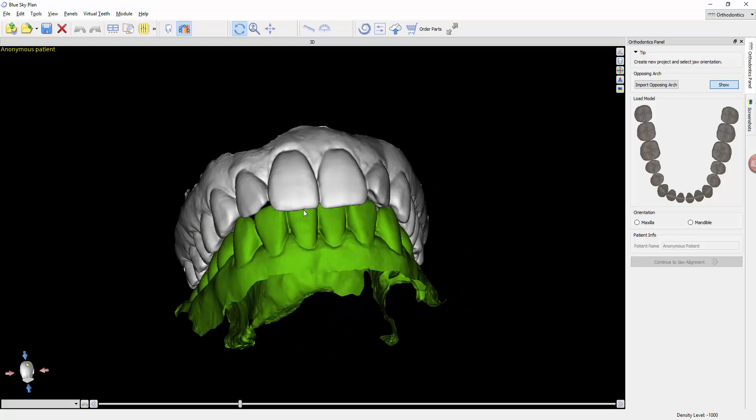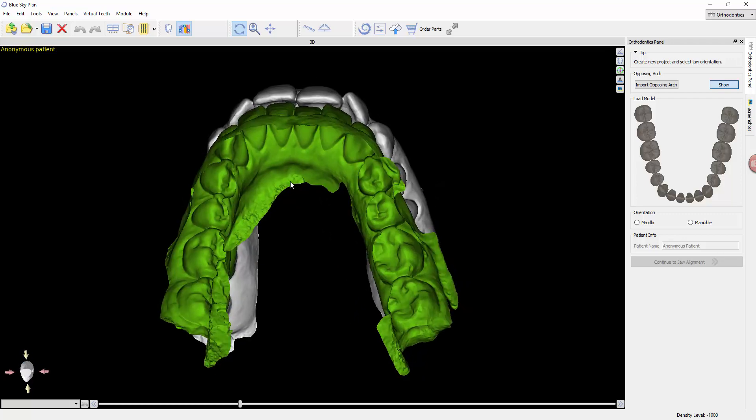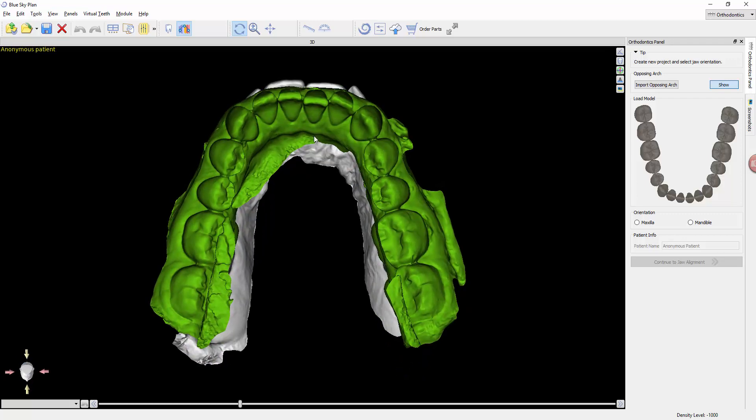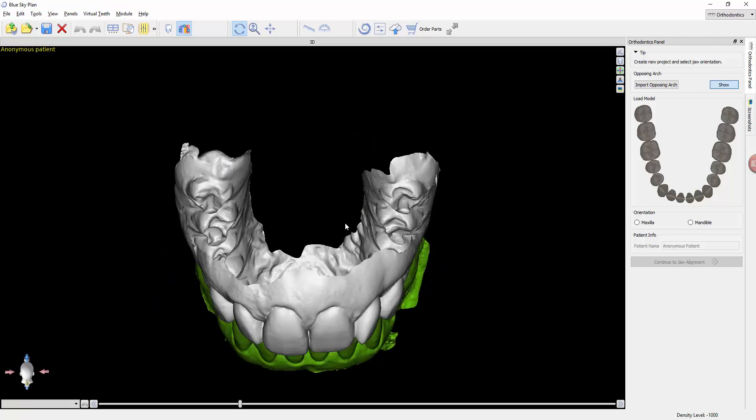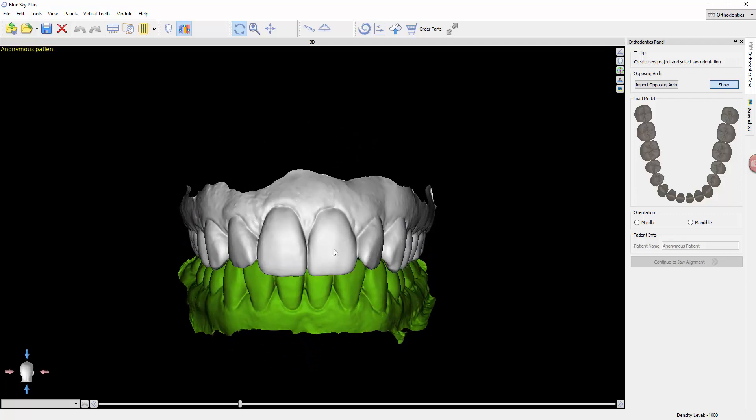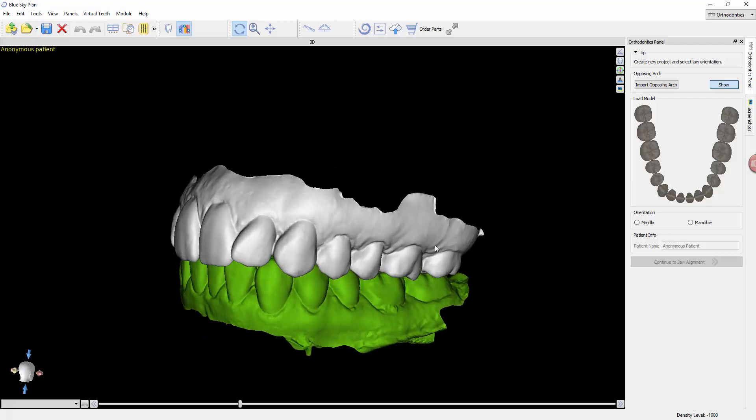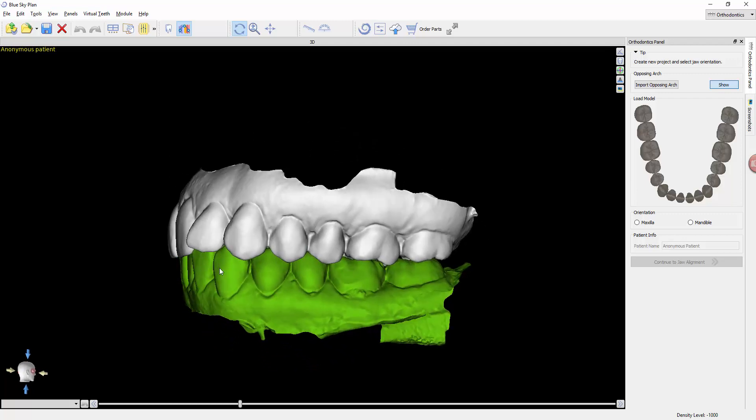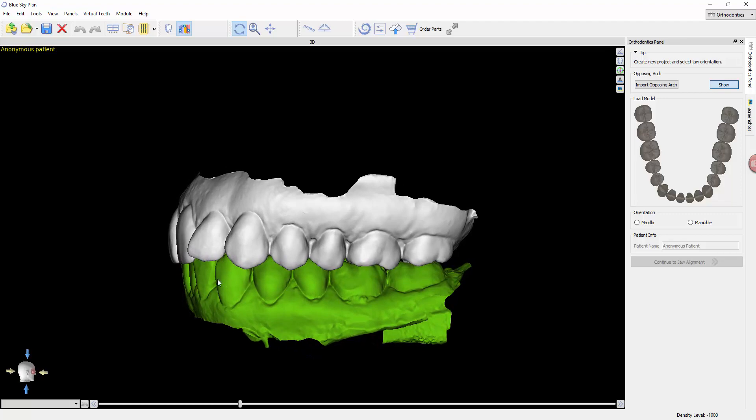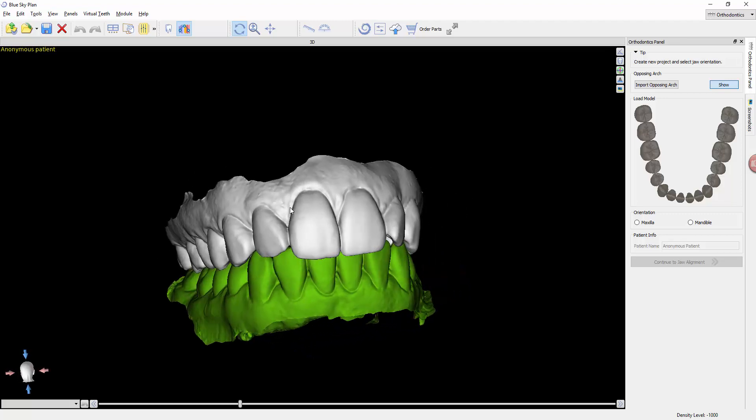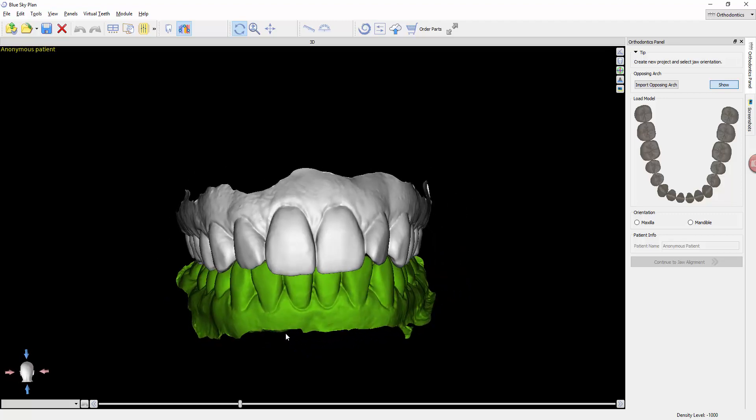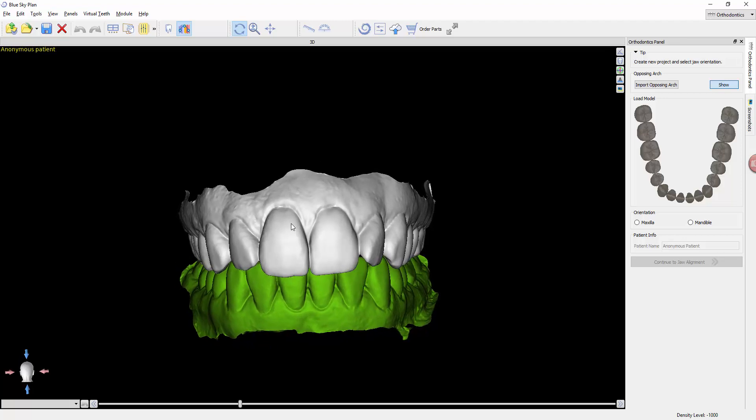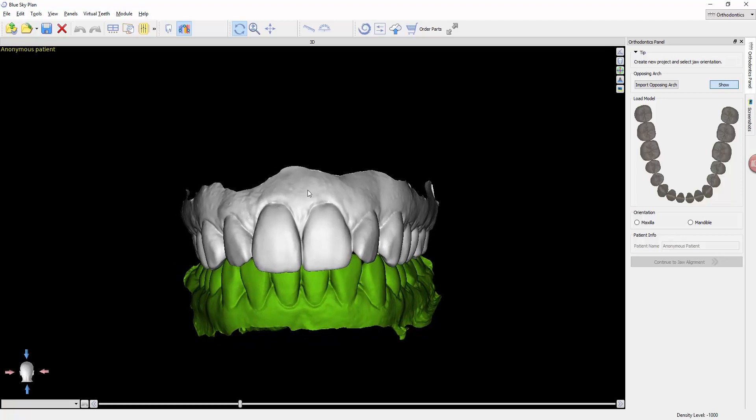They're in occlusion because when they were exported from the software that was used to generate the digital models, they were occluded there. We have not adjusted or brought them into occlusion in BlueSkyPlan. That is done in your intraoral scanner or desktop scanner software.